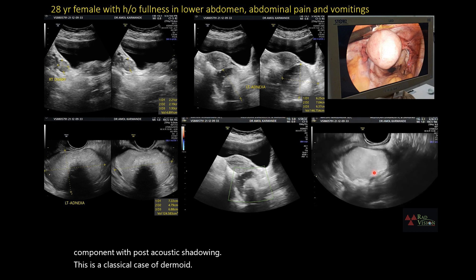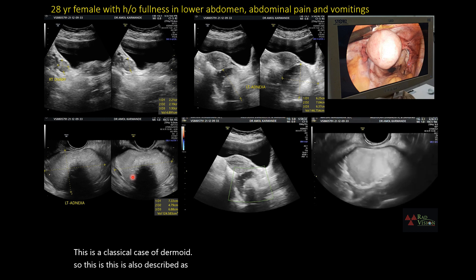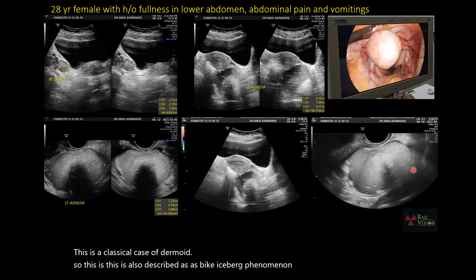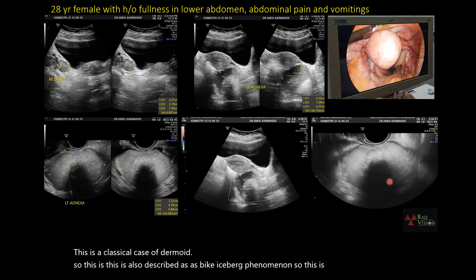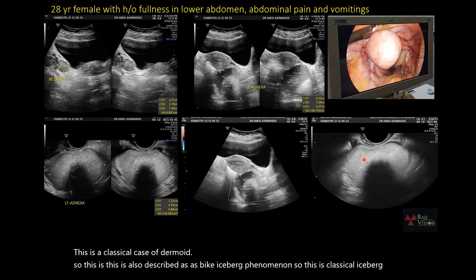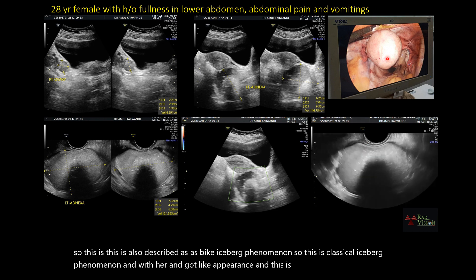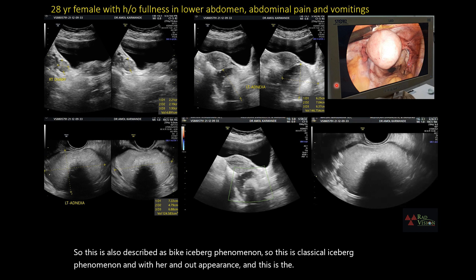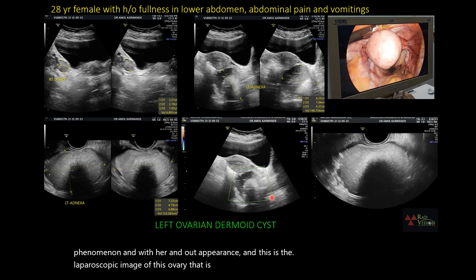This is also described as the iceberg phenomenon — classical iceberg phenomenon with hair and dot-like appearance. This is the laparoscopic image of the left ovary showing the dermoid cyst.